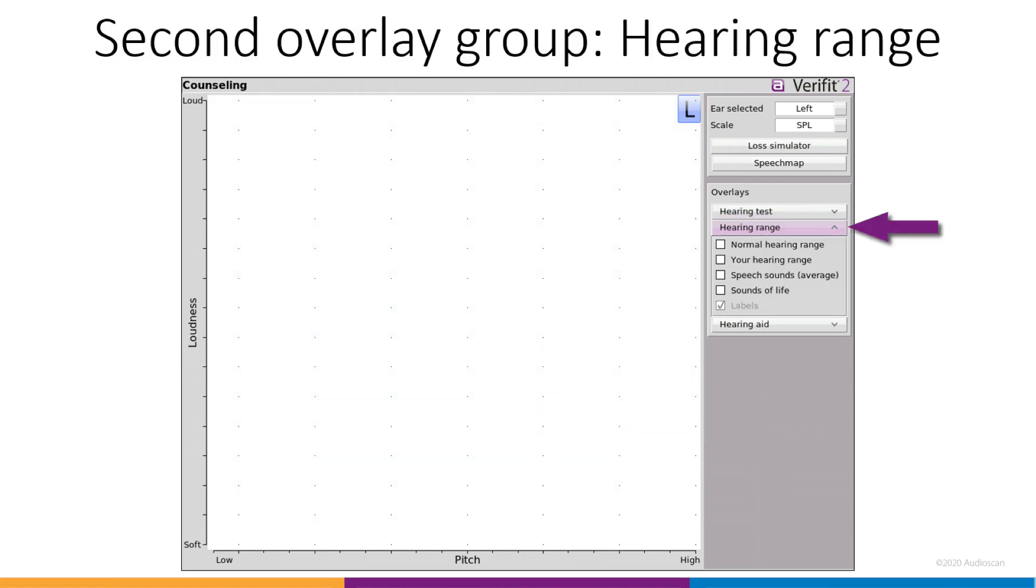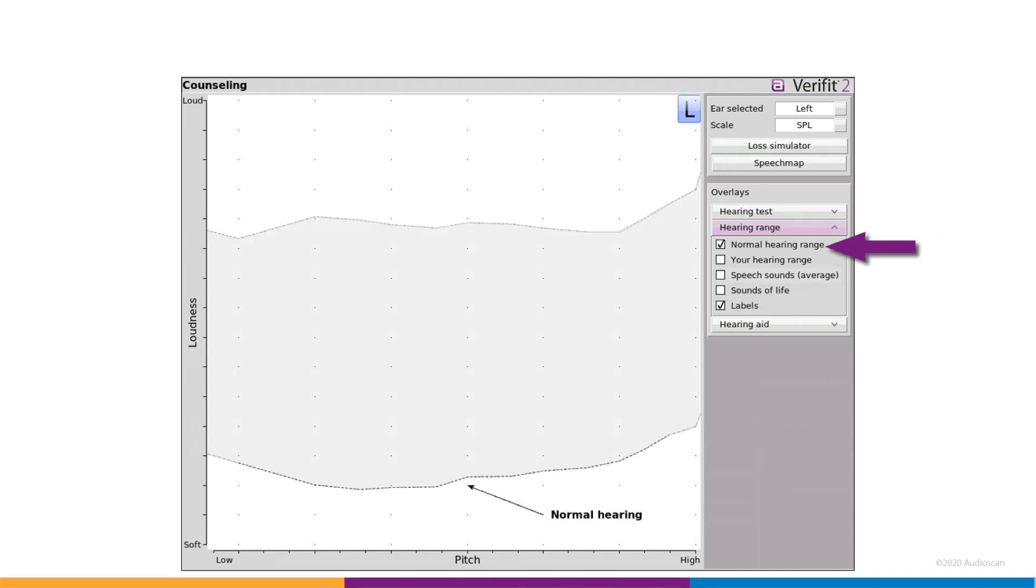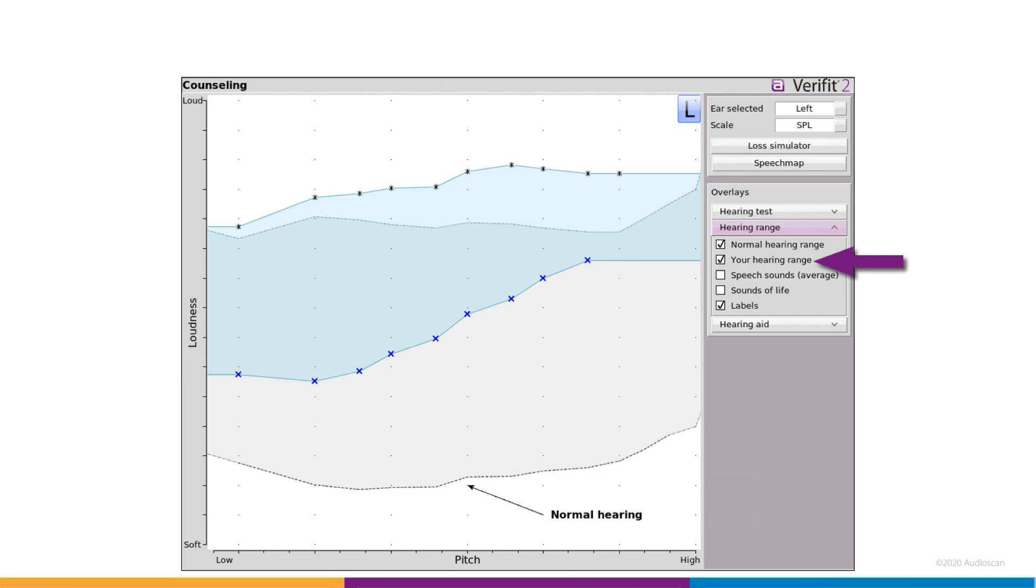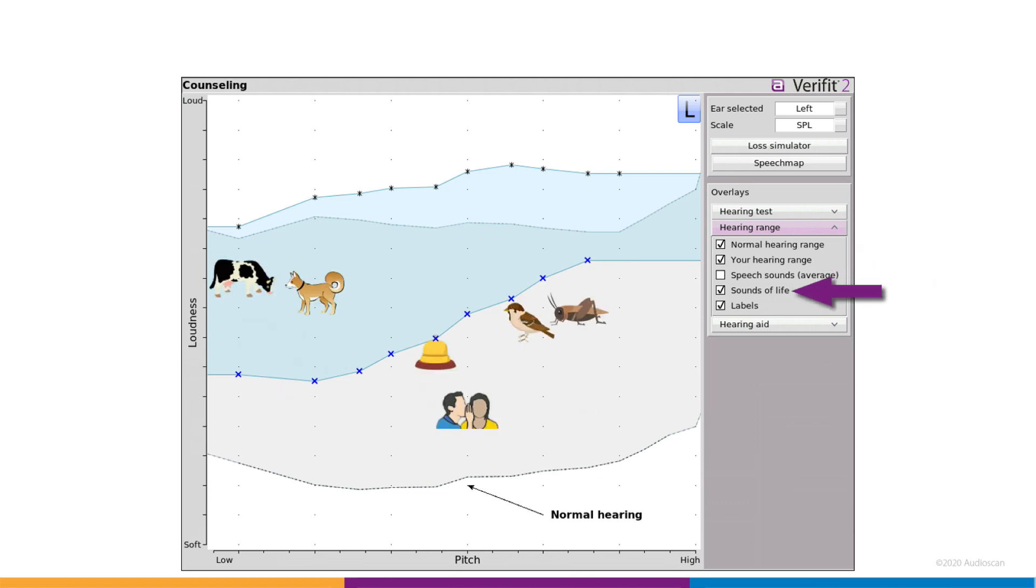The second group, hearing range, focuses on the story around reduced dynamic range. The overlays include a shaded region representing the dynamic range of normal hearing and one which represents the client's own hearing range. The upper limits in both cases will be based on UCL, either average or entered. The familiar speech sounds and sounds of life are also available in this overlay group.